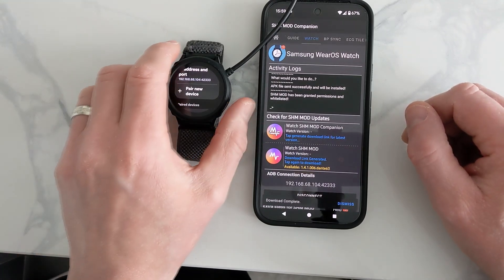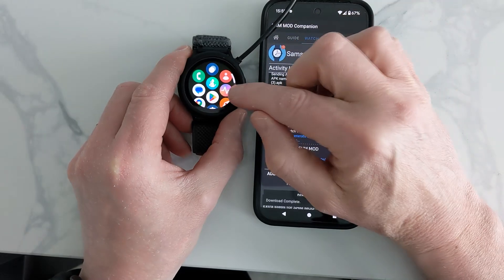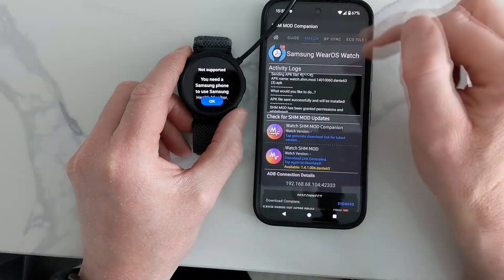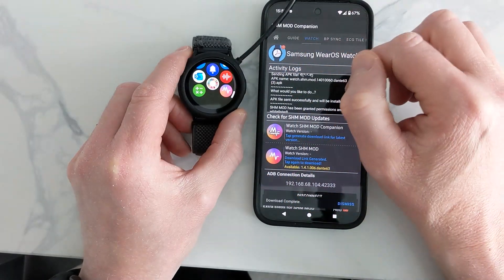That's been installed. I'll check it by going to My Apps. There's the stock Samsung Health app, which won't work because I don't have a Samsung phone, so I move right to the bottom and there is the modded version.